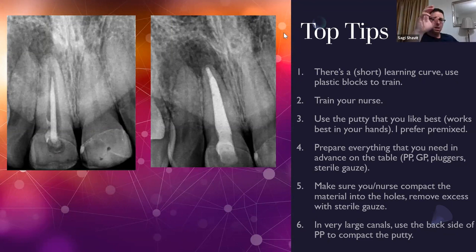If I perforated a tooth, what I will do is finish the root filling, and then deal with the perforation, if I can, if the perforation is not preventing me from doing my job. If the perforation is preventing me from doing my job, you could. All you need to do is flush the chlorhexidine with saline or EDTA, and dry, and then use bleach, and nothing's going to happen. But first, I would say finish your root filling. If the perforation is on the side, and you've got the two canals, and you're not going to re-stab the perforation with your files or something like that, deal with that later. Mm, yeah, no, absolutely.